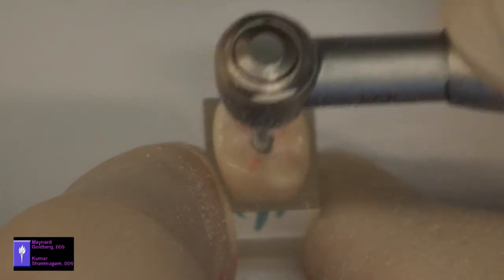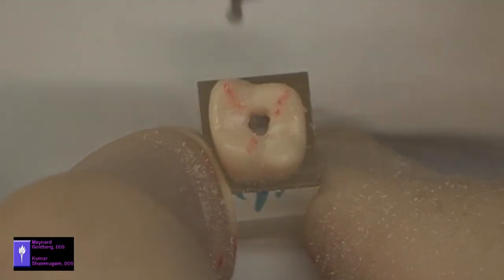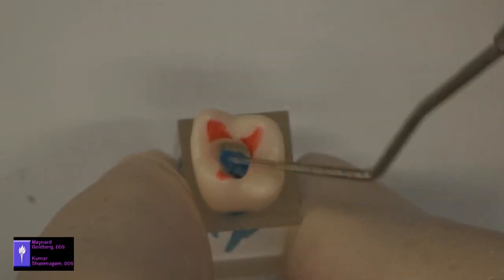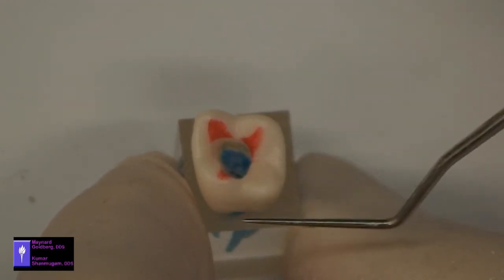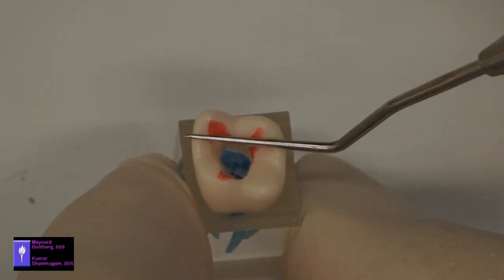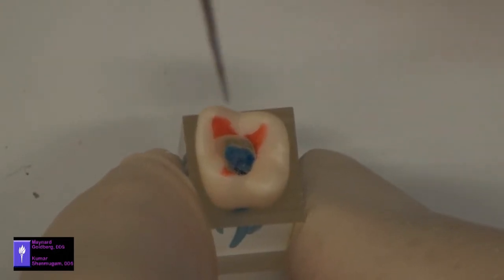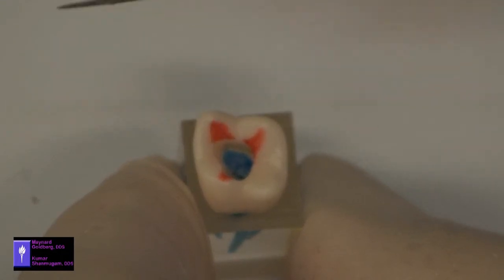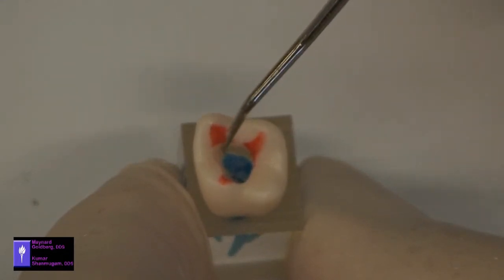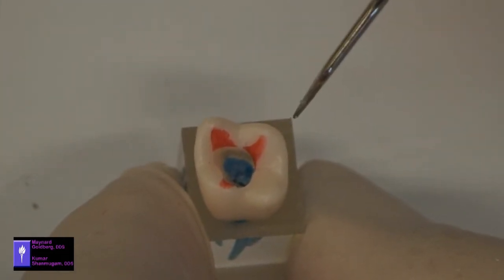the outline form of the access will follow the shape of the external surface of the tooth. Notice the access shape is similar to the external shape of the tooth itself. So here we have the buccal wall of the tooth. The mesial wall of the tooth. If done correctly, the outline form of the access cavity follows the external shape of the tooth.